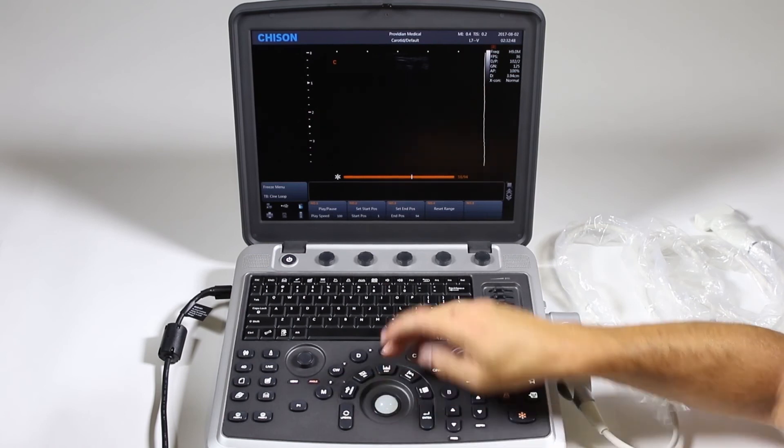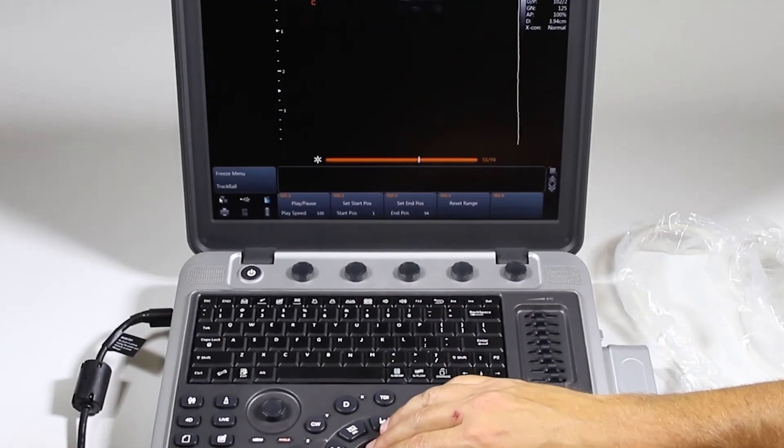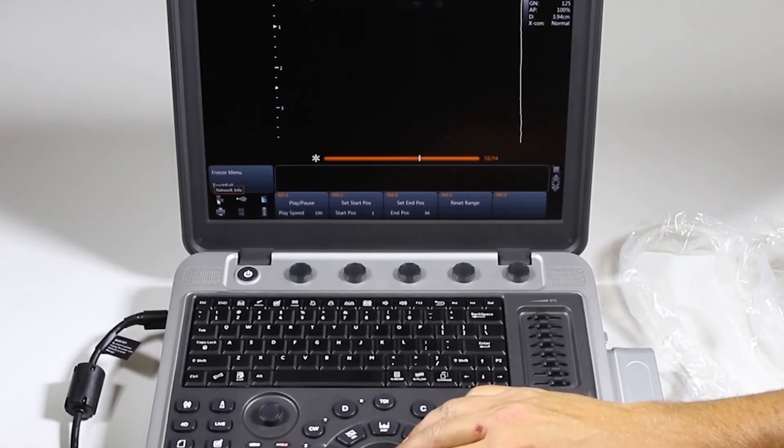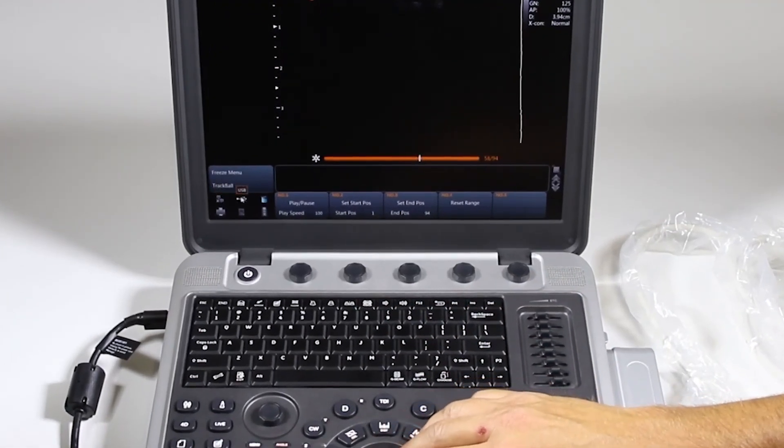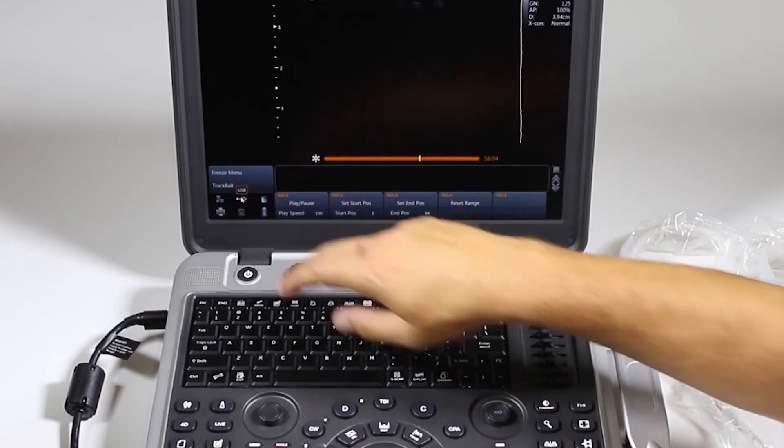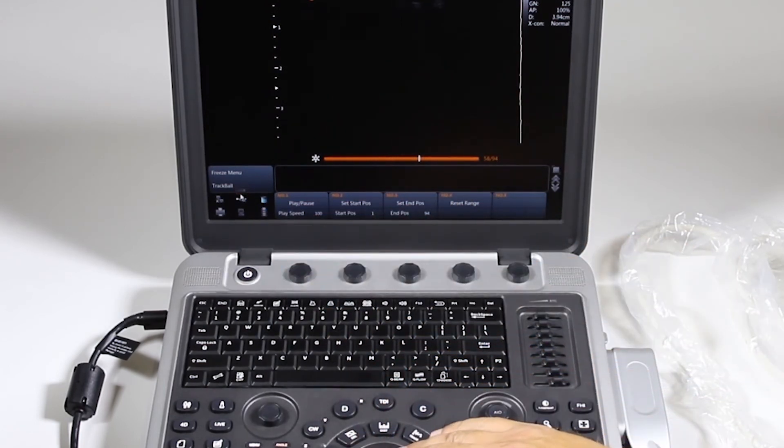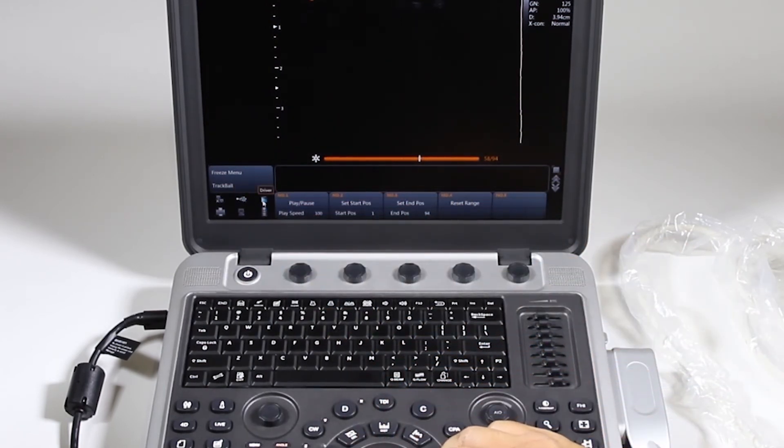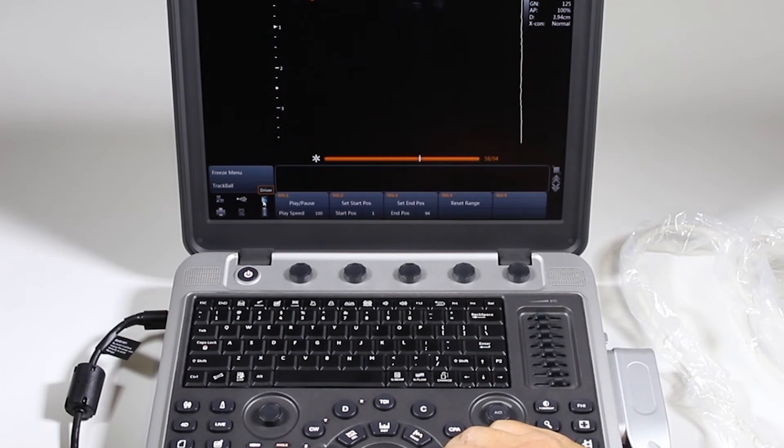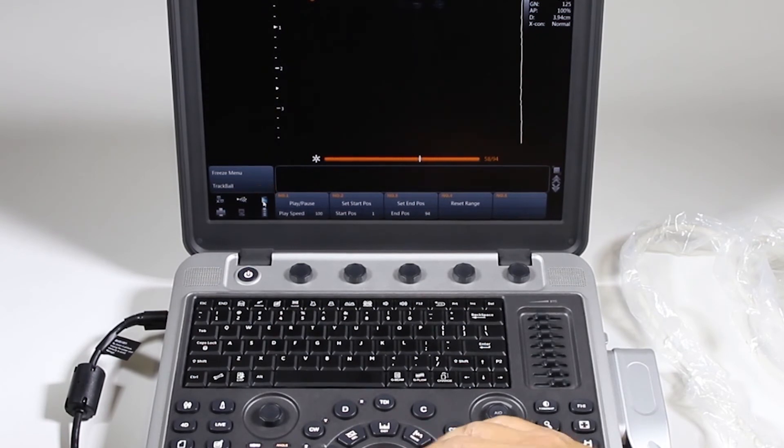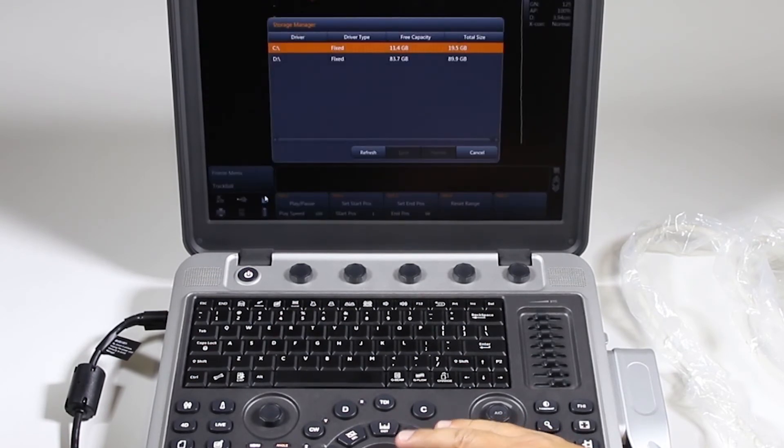We can take this, go to the cursor and hover it over. It says network information, USB, if you have a USB plugged in. This just says driver. And what this actually is, is it tells you how much space is left on your hard drive.